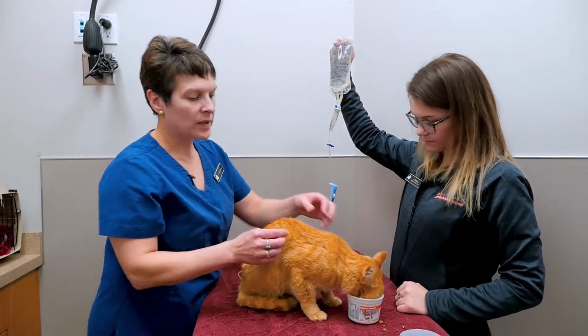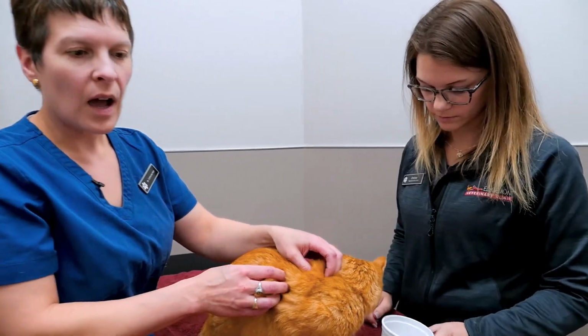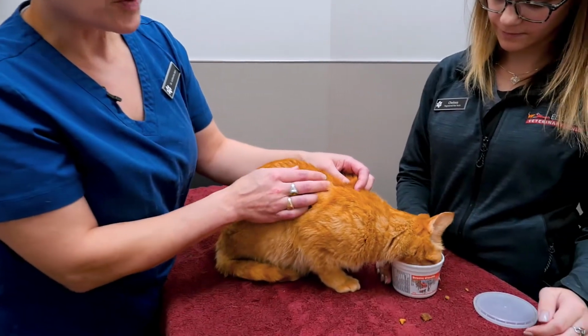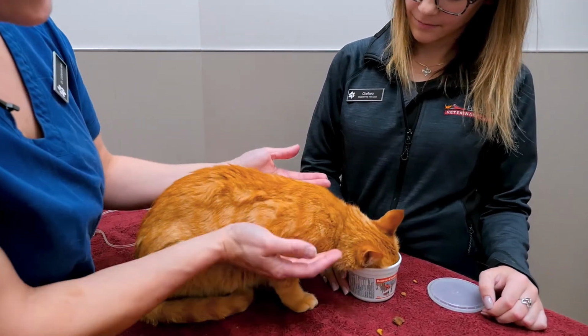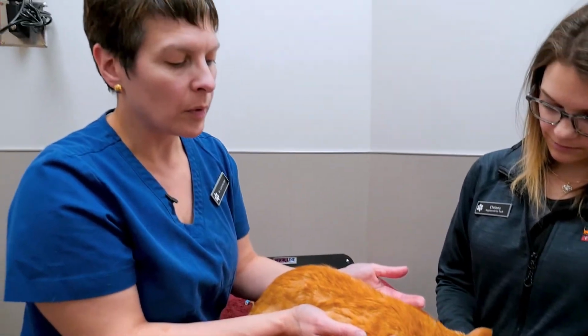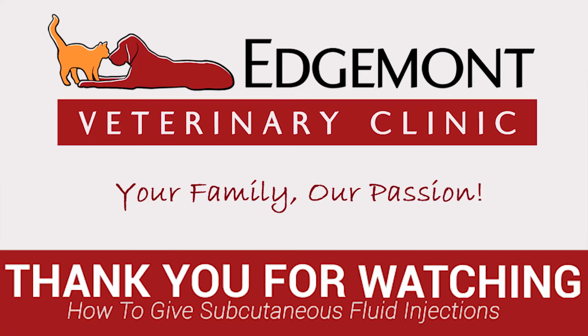When you have finished giving them the fluids, you will typically see a little bit of a bolus of fluid sitting here. I like to call it their Hunchback of Notre Dame look. They will absorb that fluid over the next couple of hours, depending on how dehydrated they are to begin with. Sometimes that fluid will fall down to either shoulder a little bit, and that's absolutely normal. As it's absorbed, it will go right back to the normal way they look.